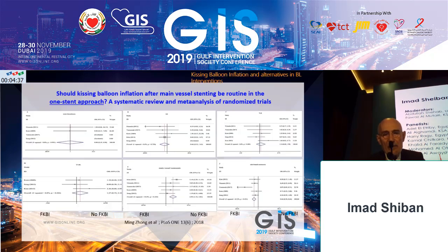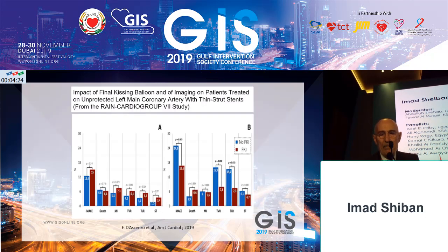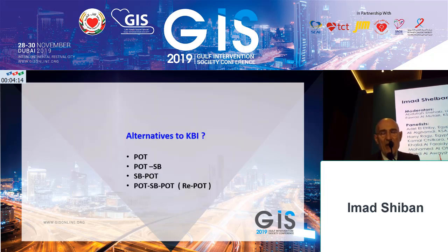And this is another meta-analysis showing the same results, that means no difference between kissing balloon inflation and non-kissing balloon inflation in provisional stenting. And this is another study from our group showing again that only a two-stent technique is benefiting from kissing balloon inflation.